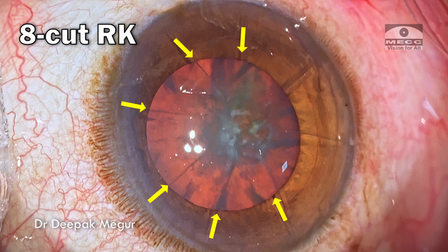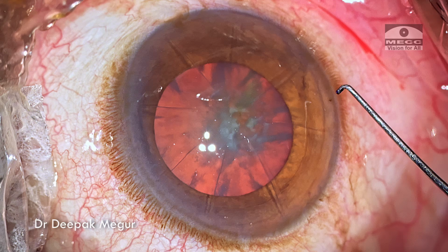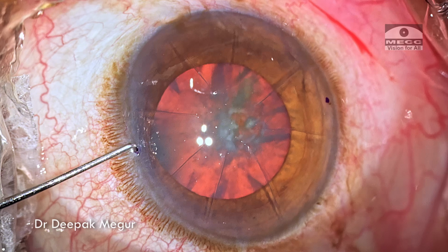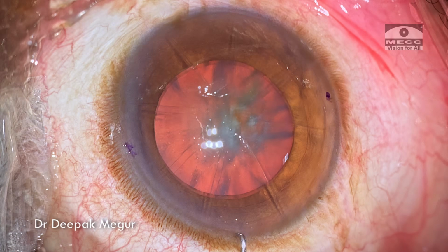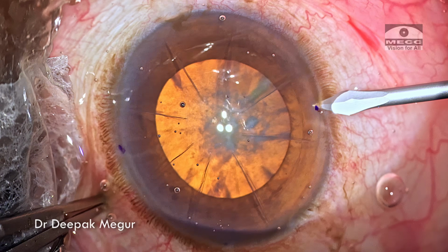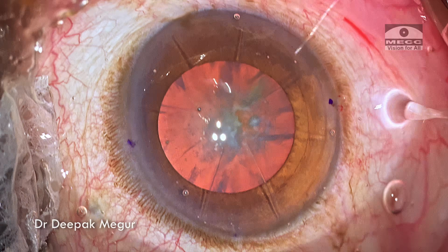So this is an 8-cut RK. To plan my incisions, I have got sufficient space. I'm using this inked dialer to mark out the areas of incision. So these are the two side ports, and this is the place where I'm going to have my main incision. Care is taken that these incisions are positioned exactly in between two cuts.